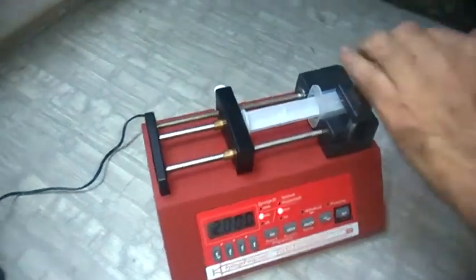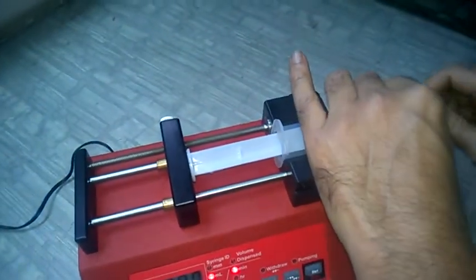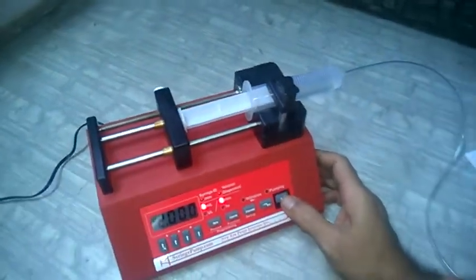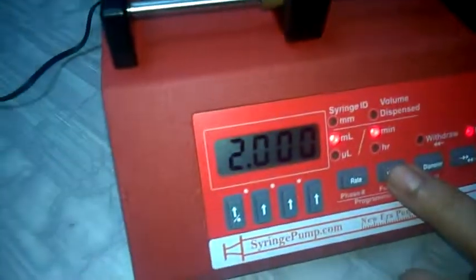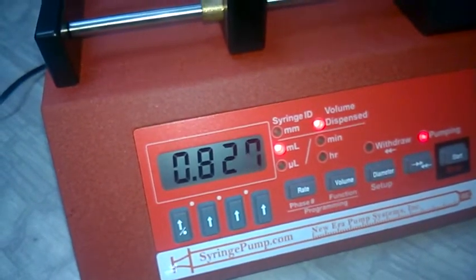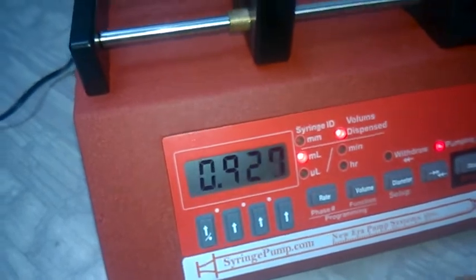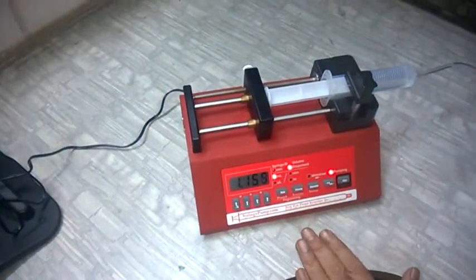I'm just attaching a small tubing and now press Start. The pump will start pumping and infusing. If you want to see how much volume has been dispensed, press the Volume button — it will display the volume in ml. As you can see, it has already dispensed 0.78 ml.